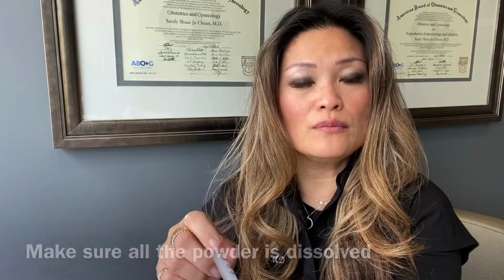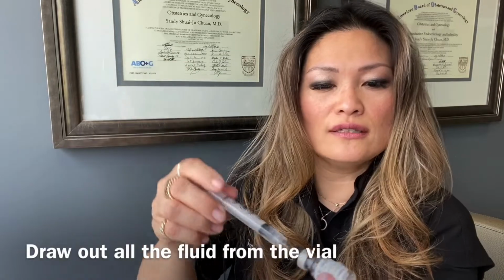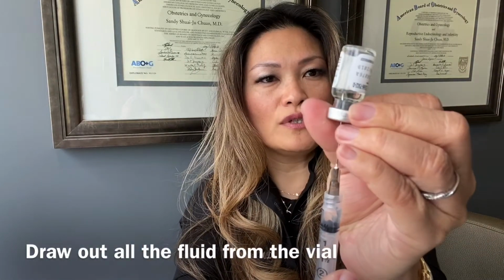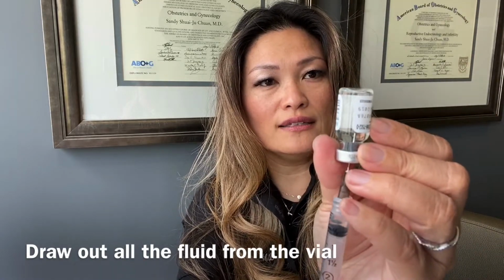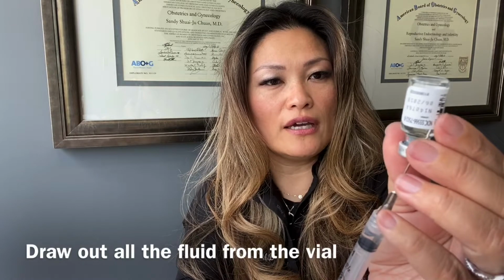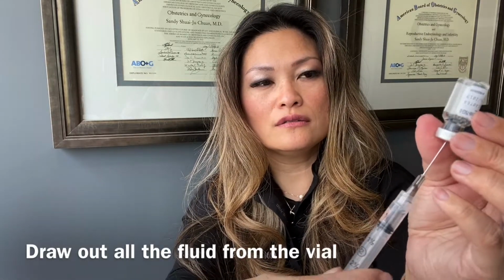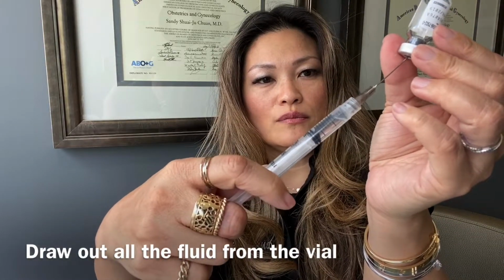So now you want to pull this out. If this is your injection, then obviously you're only doing 75 units. You want to take this out. So again, always turn the bottle over. Make sure the needle is within the fluid, not in the air all the way up. You don't want to draw up a bunch of air. And then just pull back on your syringe, kind of like how I'm doing. Just pull it, pull it, pull it.